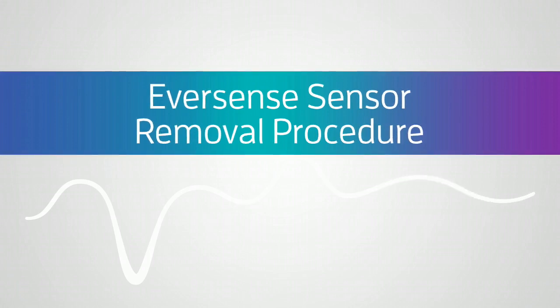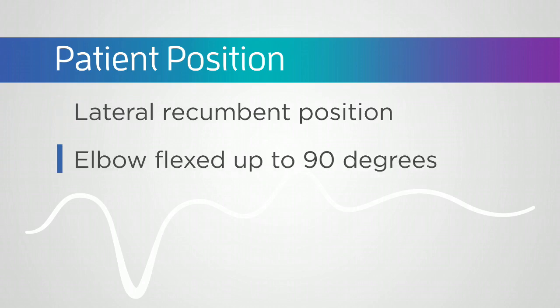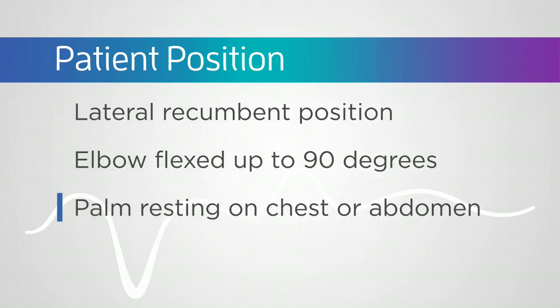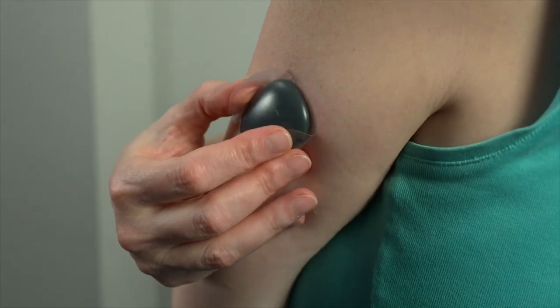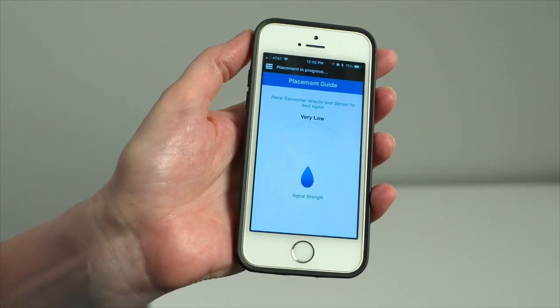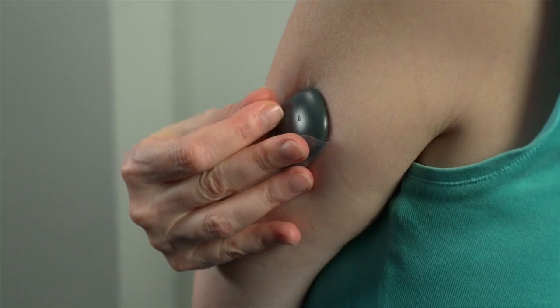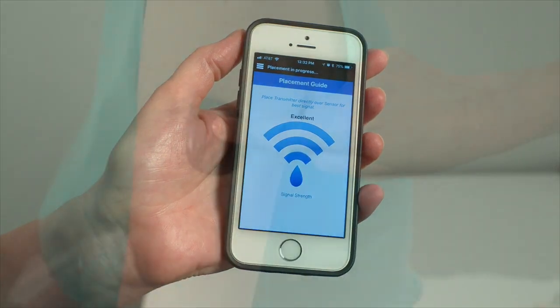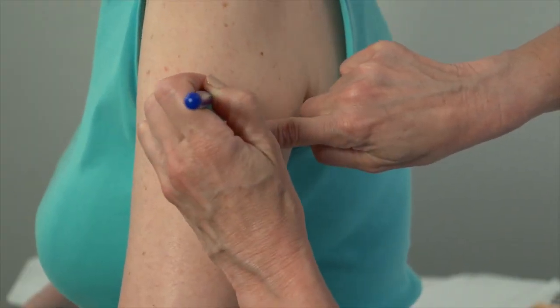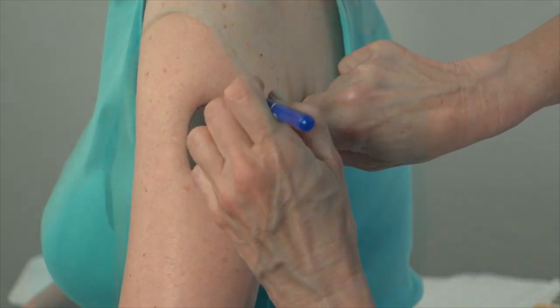Begin the removal of the Eversense sensor by positioning your patient in a lateral recumbent position, with the elbow flexed up to 90 degrees and the palm resting on the chest or abdomen. You can place a pillow under the patient's arm and head for comfort. Have your assistant locate the sensor with the placement guide in the Eversense mobile app. Have the patient use his or her smart transmitter and placement guide to find the sensor's greatest signal strength. Mark the edges of the smart transmitter at this location with the surgical marker found in the smaller kit package.